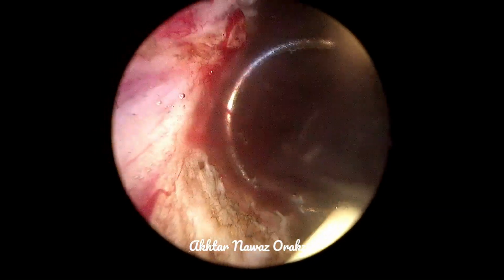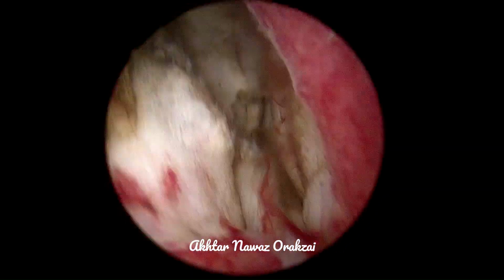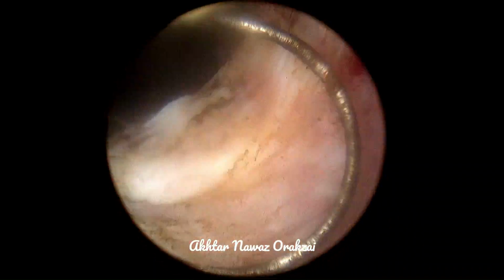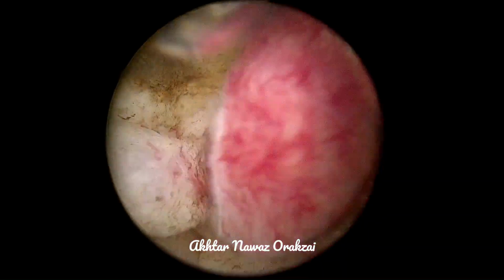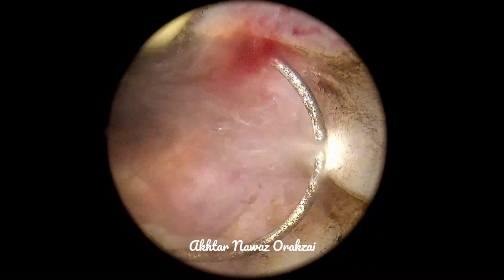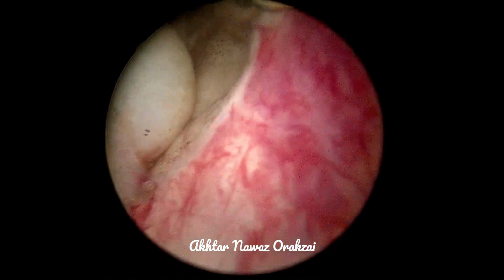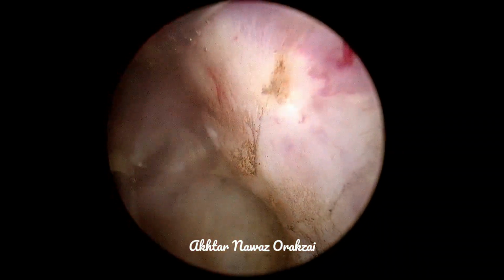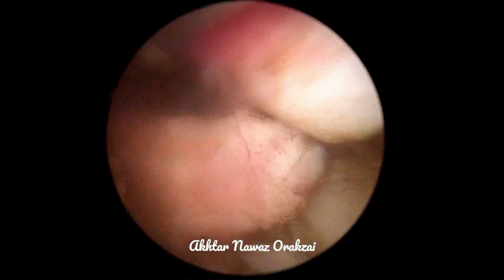You always coagulate the resected areas before starting resection of a new area, because you will be facing new bleeders while resecting, and if the prostate is bleeding from the contralateral lobe as well, this will lead to impairment of the vision, and the procedure will become more and more difficult.